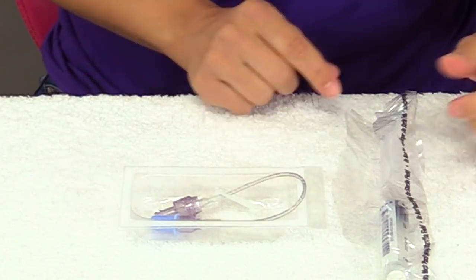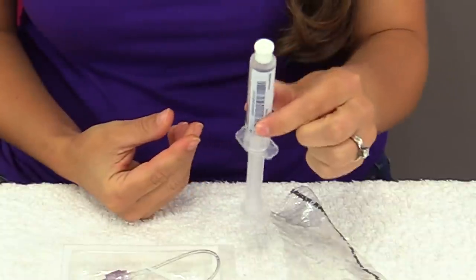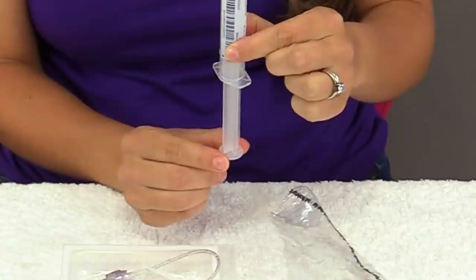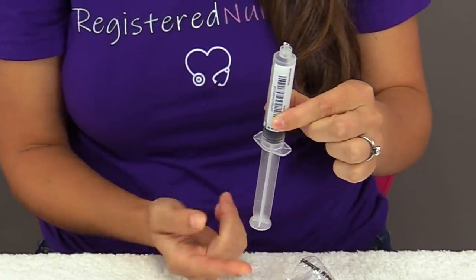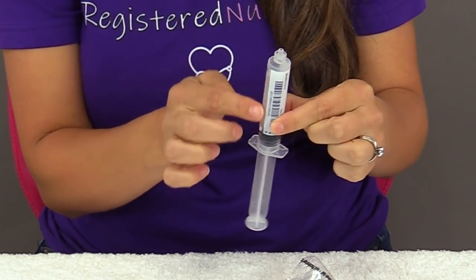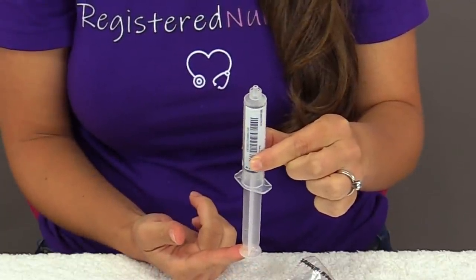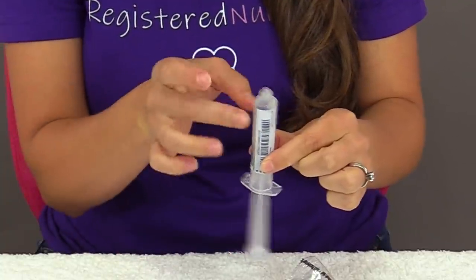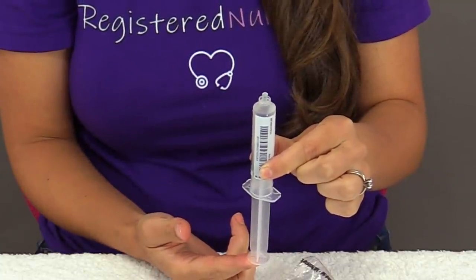Then I like to get my saline flush and prime it by removing its air bubble. You want to take that cap off and then slightly pull back on the plunger. You can flick it a little bit to get any air bubbles in this area to move up, and then push the plunger up to expel that air and wait for some saline to drip out. Flick a little more if you have to, then push until all that air is removed.